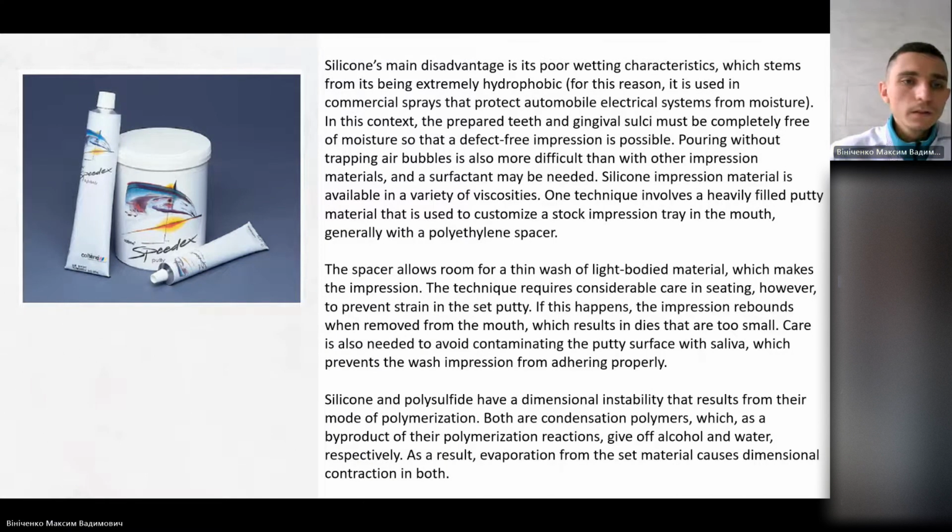Here in Morocco, we have the polyether impression for a precise impression. Polyether you use, yes? Yes, polyether impression. We use the polyether. We also use the silicone, but more often the polyether. The polyether is a great choice, but it's an American product too, so it's very expensive to buy. Yes, it's very expensive.